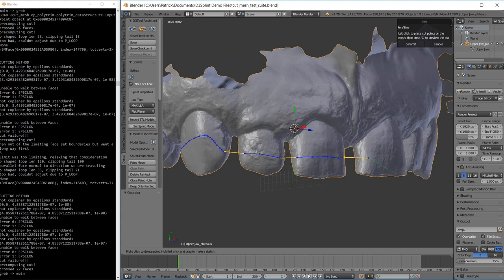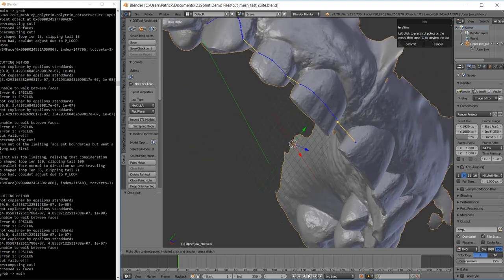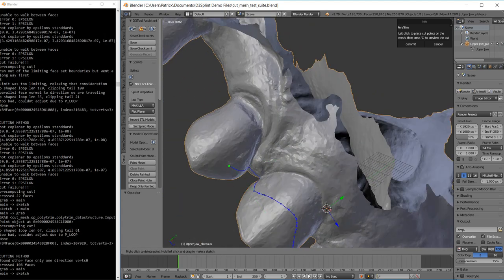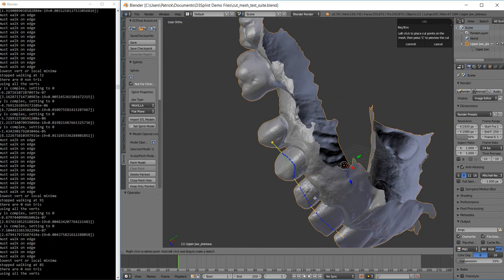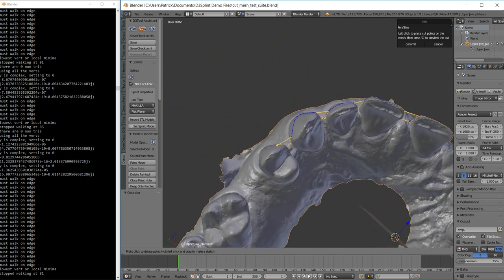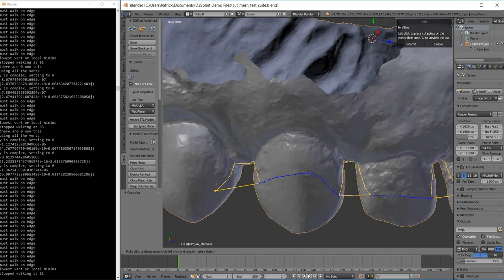Then what we'll have it do in the background, while the user is doing other things, is search for the closest nearby point through these things called geodesic walks, so that's what you see here. This is the fastest way to get from here to here while staying on the mesh. That's one option if you're trying to end up with a solid closed surface: it's going to propose these little cutouts for you, and you'll be able to click it and accept it.